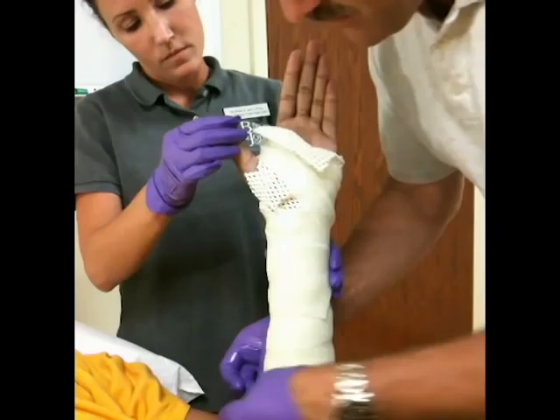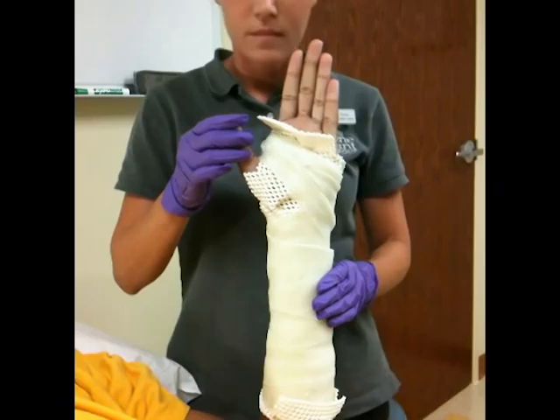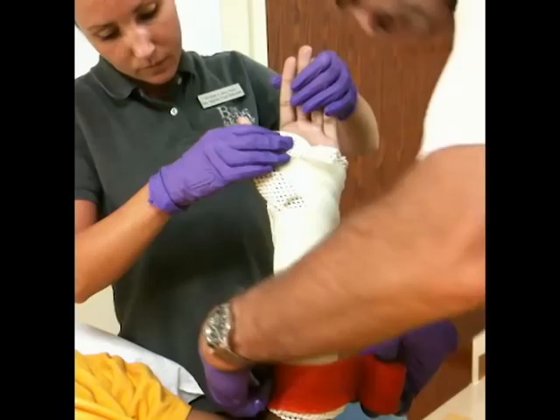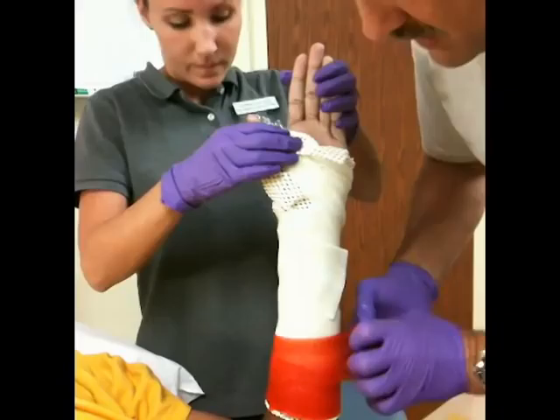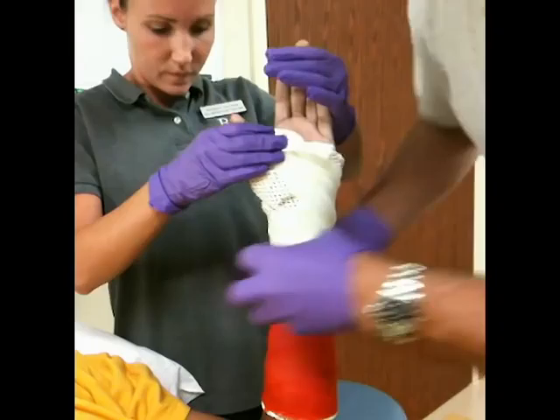We fold the flaps of the padding down and up, and apply the second layer. The padding material is very soft and you can fold it on itself or double it up — that's not an issue. It doesn't cause any skin irritation unless something is pushed down into the cast and the padding is wadded up.